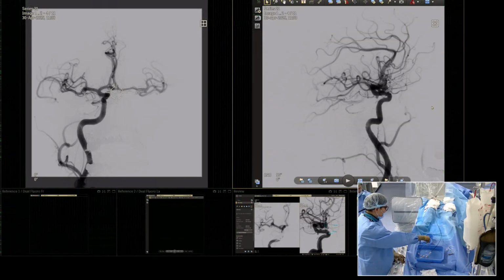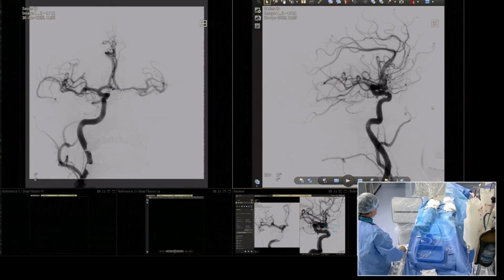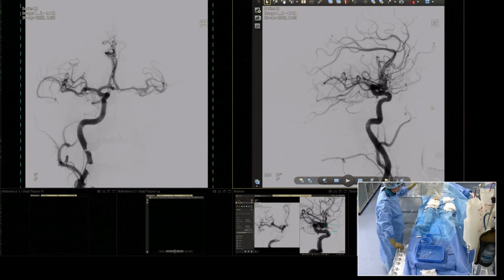And then next patient is a frontoparietal lobe AVM. We treated at the end of March together with my friend Alberto Gil from Spain, and today I hope we will see. It's a brain AVM on the right hemisphere. Okay, let's wait for the control CT and then we can decide.